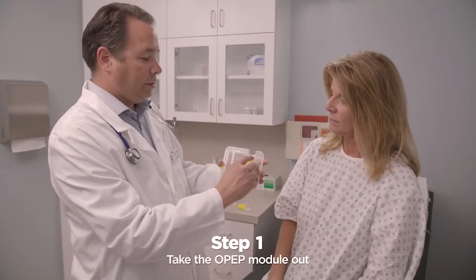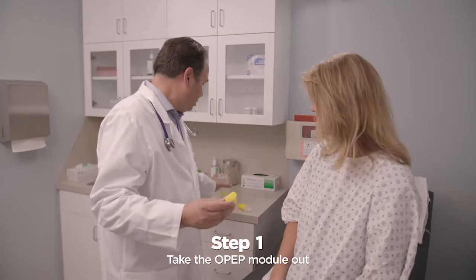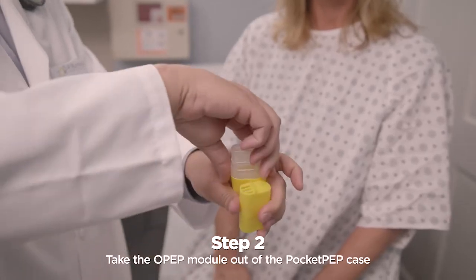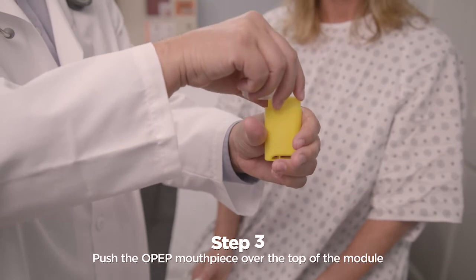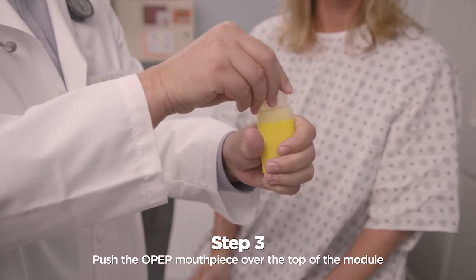With the back of the IPEP facing you, take the OPEP module out by pushing down on the vents and out towards you. Put the OPEP module in the Pocket PEP case, making sure that the module foot goes in first. Push the OPEP mouthpiece firmly over the top of the module and push until it clicks onto the case.